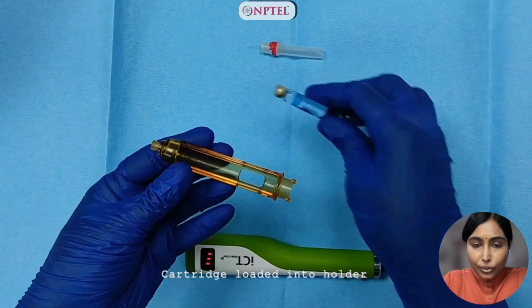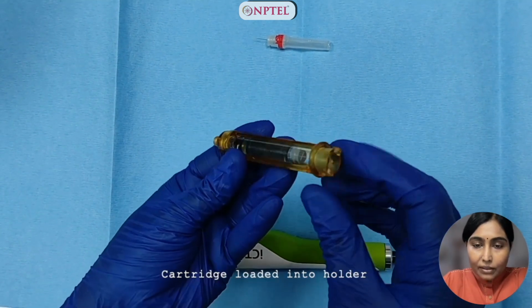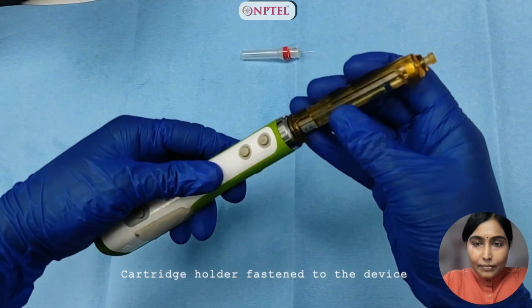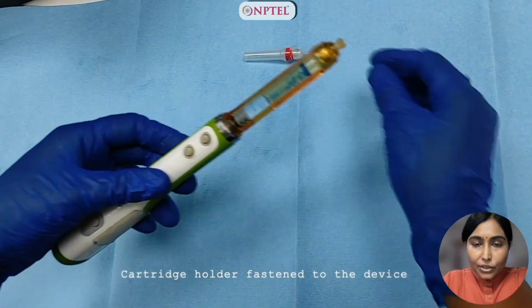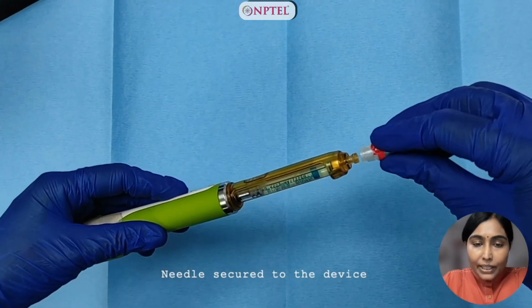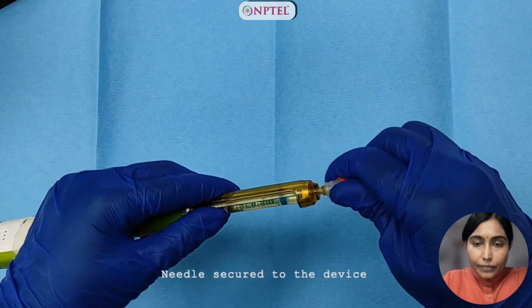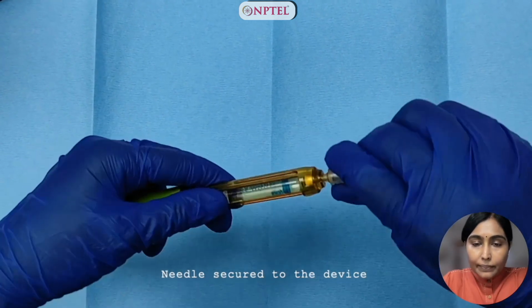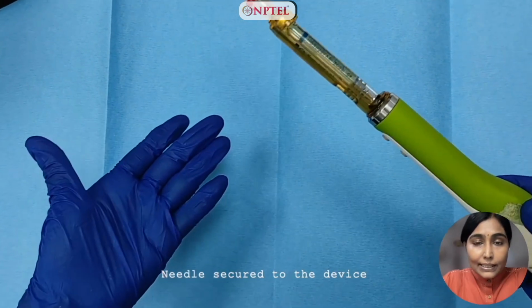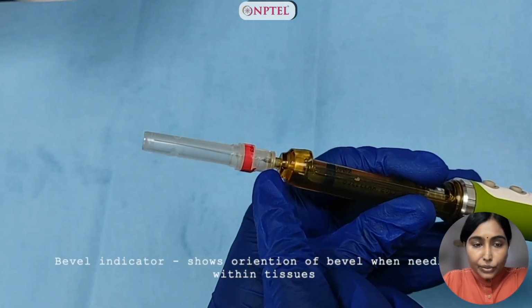This is the cartridge holder. Now we load the cartridge into the holder. Now the cartridge holder is inserted into the C-CLAD device. The needle is being secured to the device. Make sure it is secured properly. It is threaded nicely. And the device is ready for use.